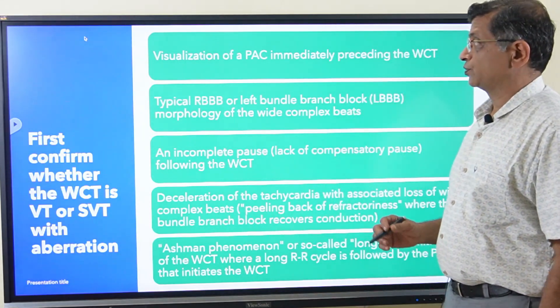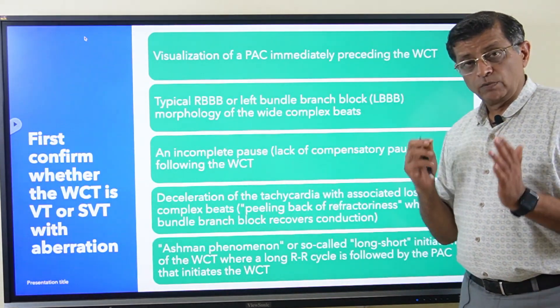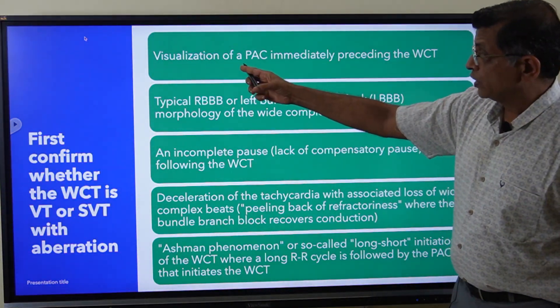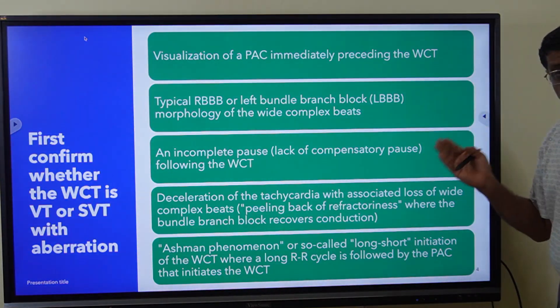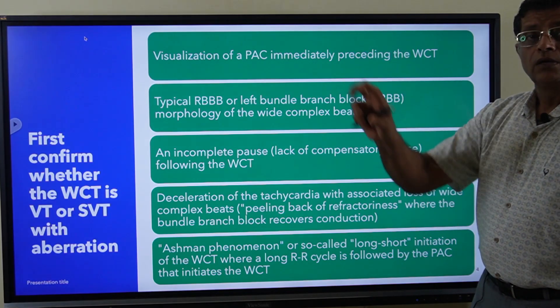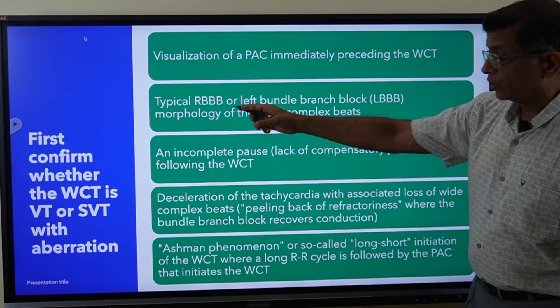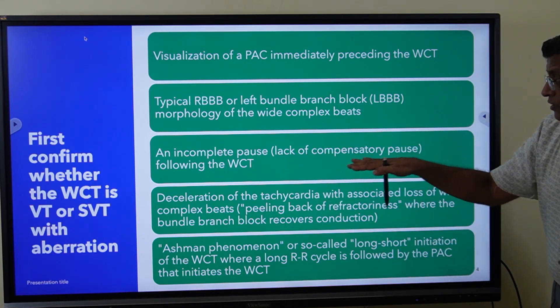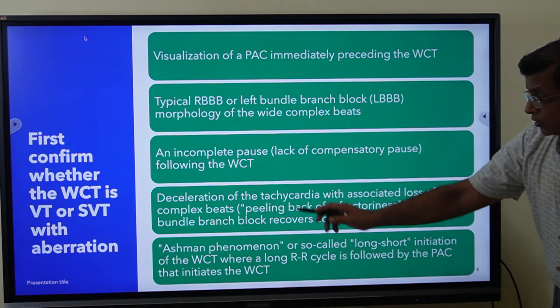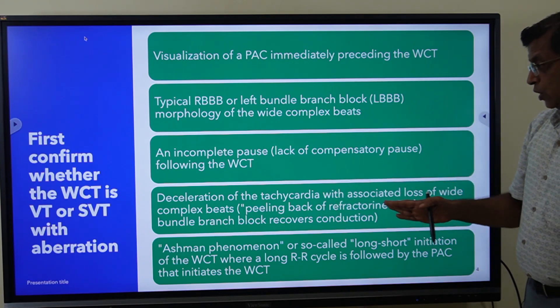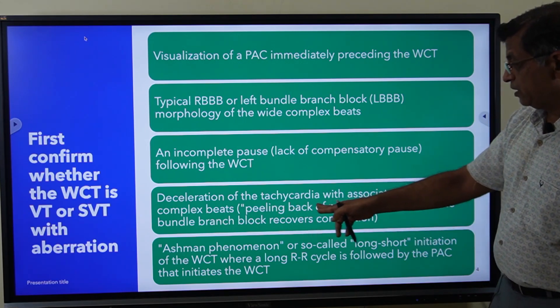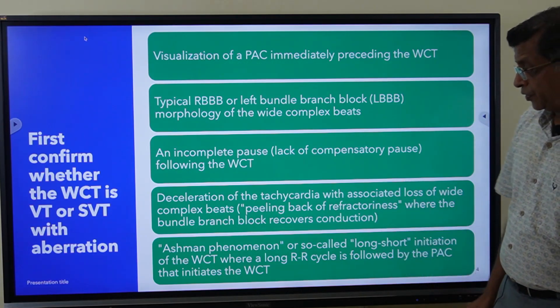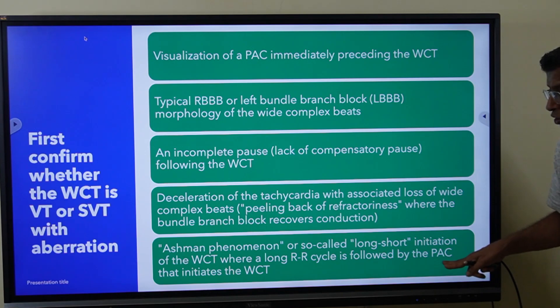Whenever you see a wide complex tachycardia, first confirm whether it is ventricular tachycardia or supraventricular tachycardia with ventricular aberration. Points suggesting aberrant conduction rather than VT include: visualization of a PAC immediately preceding the wide complex tachycardia, a typical rSR' pattern or right bundle branch block morphology, an incomplete or lack of compensatory pause, or the wide complex tachycardia gradually decelerating with peeling back of refractoriness where the bundle branch block pattern disappears into sinus rhythm.